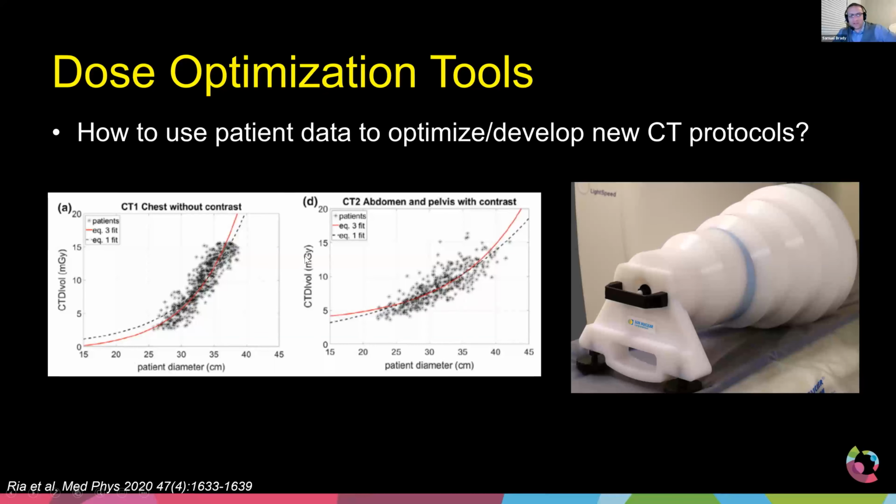The red line you see here is, according to this publication that just came out last year, they looked at this phantom and they asked, does this phantom mimic actual patient data? And that red line represents yes. So in other words, I have confidence that I can scan this phantom and start adjusting things, image quality, dose, and all that stuff. And I know that if I do it first, let's say this middle slice, it's going to represent my patients that are 30 to 35 centimeters thick. And so that's a great thing. So you guys could, if you wanted to, invest in maybe one of these phantoms, and maybe a couple of them regionally, and your medical physicist can take them around.